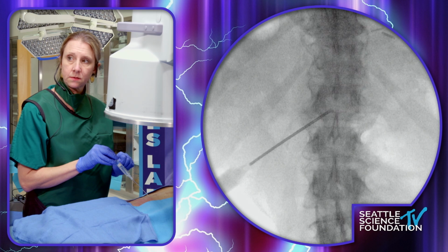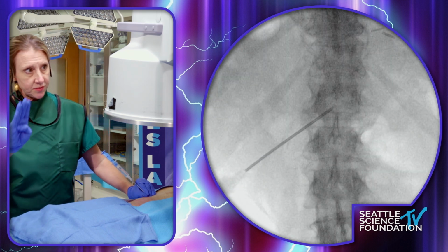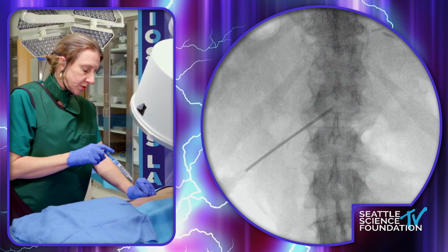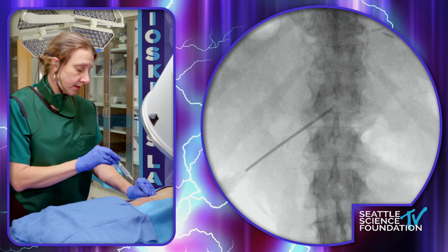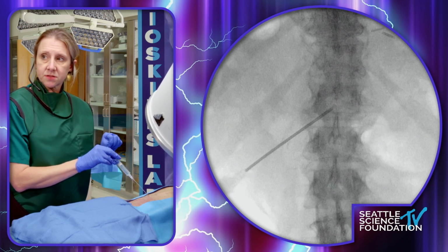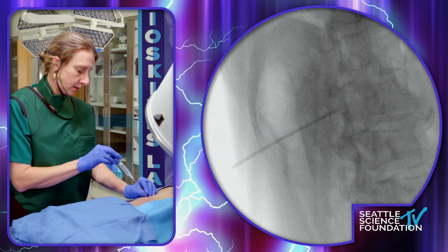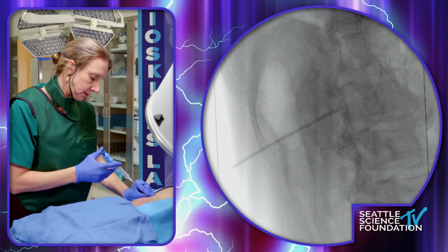Could I please have the C-arm tilted 45 degrees your direction? So for secondary views, to inform me on my depth and how near I am to entry into the epidural space, I'm going to use a contralateral oblique. And you probably need to lower, oh, that'll work fine. So I'm nearly there, as everyone can see. Very close.